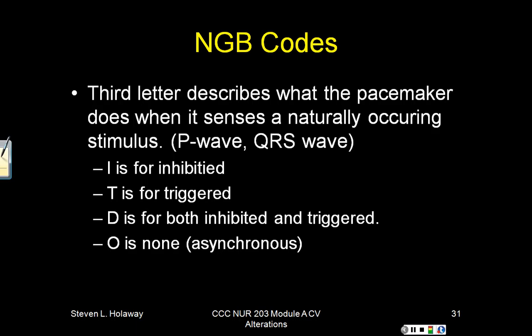But typically, what we're seeing these days are DDD pacemakers. So it's pacing in both chambers of the heart, it's sensing in both chambers of the heart, and it can be inhibited or triggered to fire a stimulus.